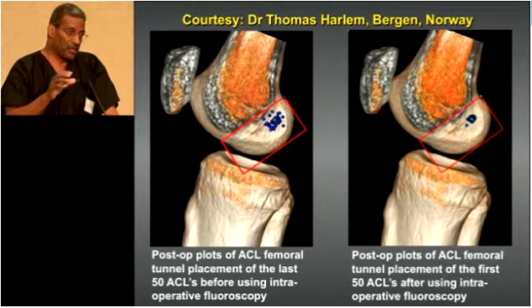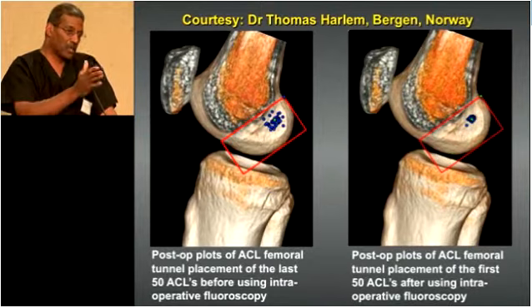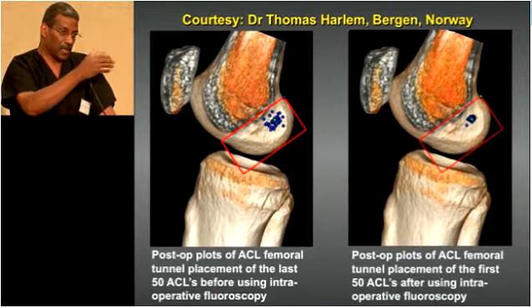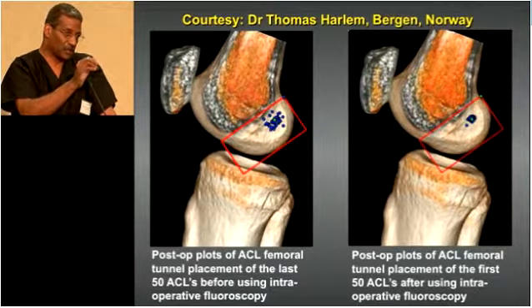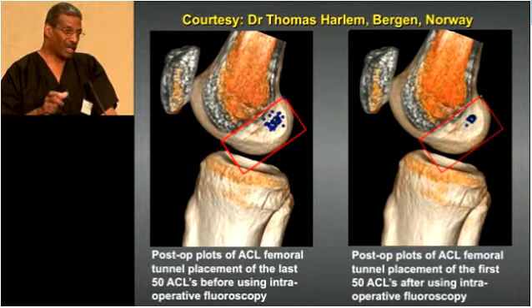If you're using a soft tissue graft, I want an elliptical tunnel so I cover more of the footprint, so I drill more elliptically based. I'll adjust the fluoroscopic image to take that into consideration. So with the fluoro, you can dial in what you want. Whatever position you want, you can check it, verify it, and then drill the tunnel.